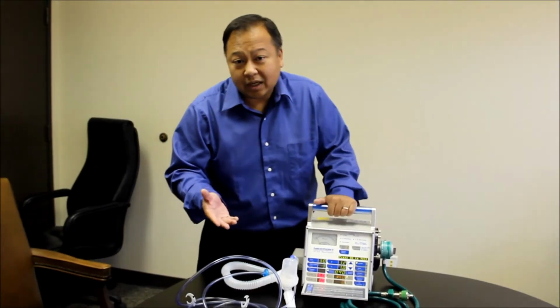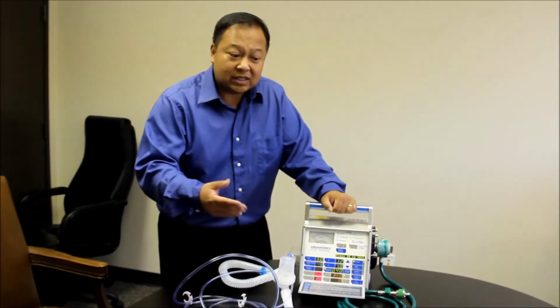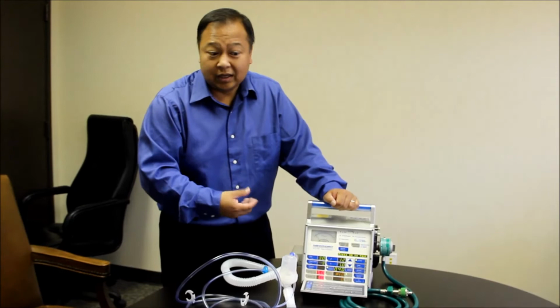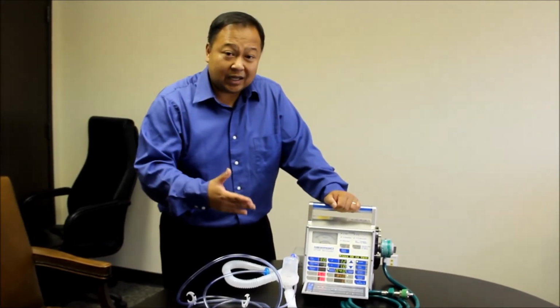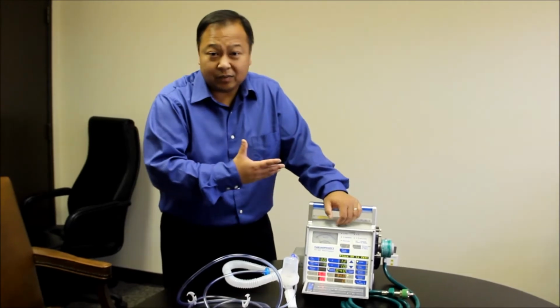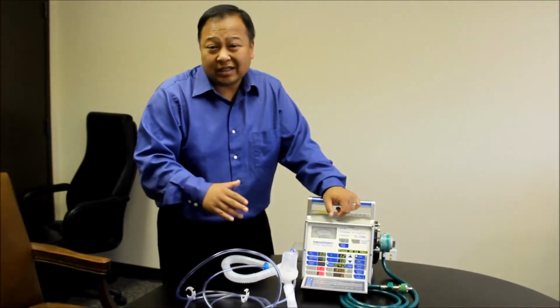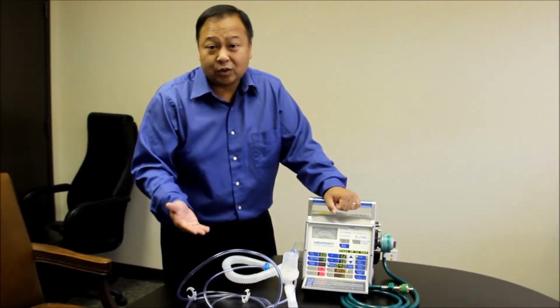The next mode I'm going to be talking about now is the SIMV mode, the synchronized intermittent mandatory ventilation. So let's say, for instance, we want to keep the same settings because the patient is doing well, blood gas is coming back well, everything's going well. So we want the patient to be weaned off the ventilator. We don't want to keep the patient on the ventilator forever. It's called a transition phase. So we're going to transition the patient from assist control to SIMV mode.